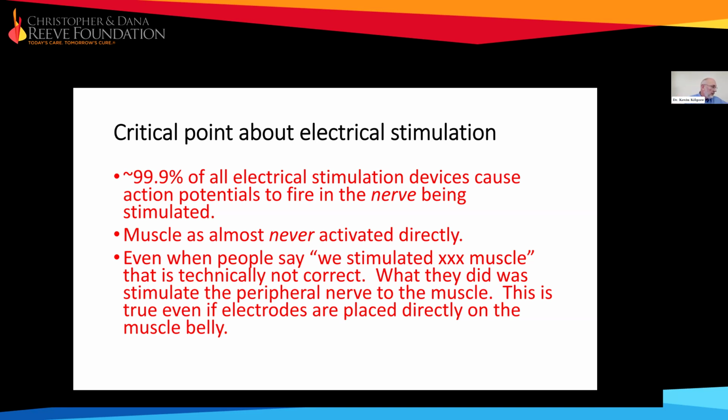When we talk about our implanted devices for, let's say, hand function, then that control is different. I'm going to show you some videos that I hope will help explain how we give the person who's using the stimulation, let's say for hand function, control over that so they can use it when they want to reach out and pick up a glass or something like that.